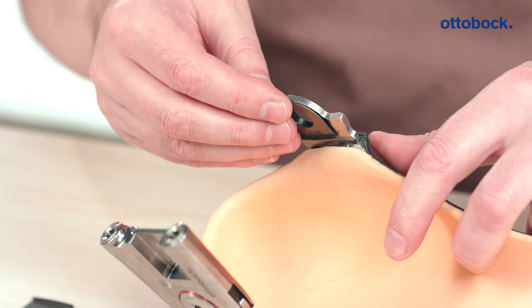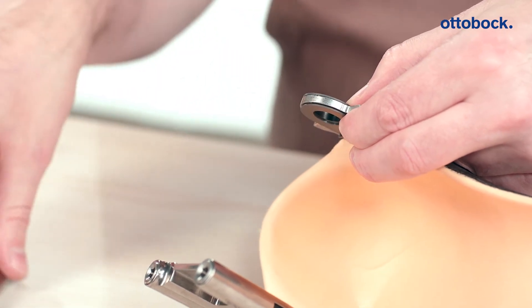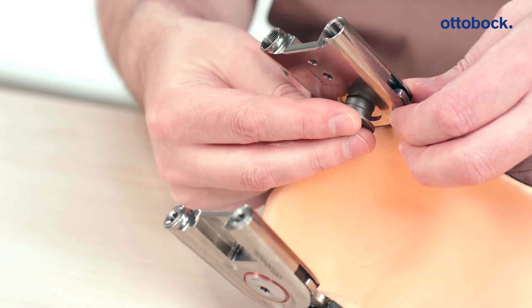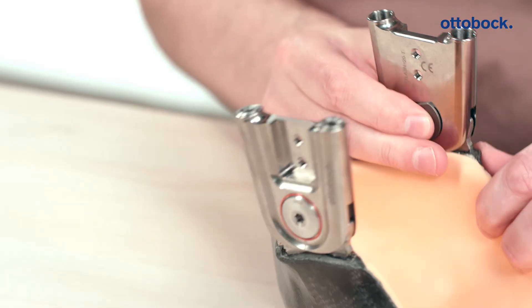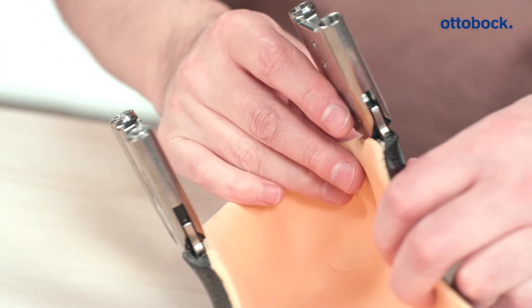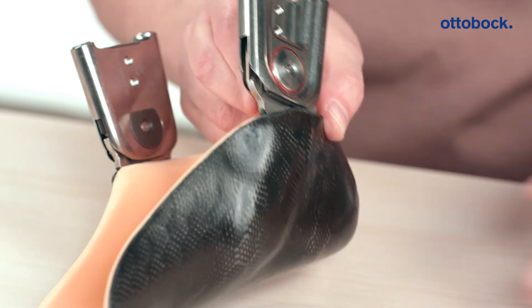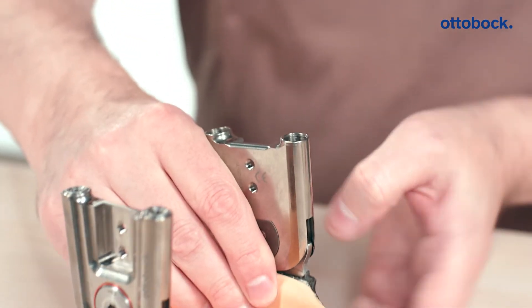When installing the joint in the orthosis, simply position the two selected axial washers on the foot stirrup and slide them into the joint. The mechanical stop must fit flush with the rectangular retainer for the axial washer to sit optimally in the joint. Then fit the bearing nut to the back of the joint and tighten it from the front using the joint screw and the specified torque. The corresponding torques are indicated on the joint screws or in the instructions for use.